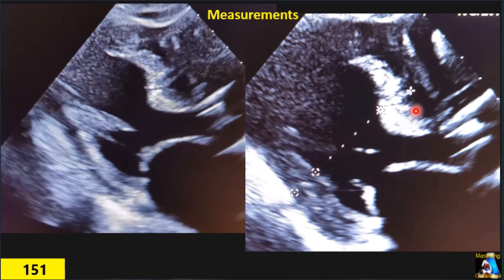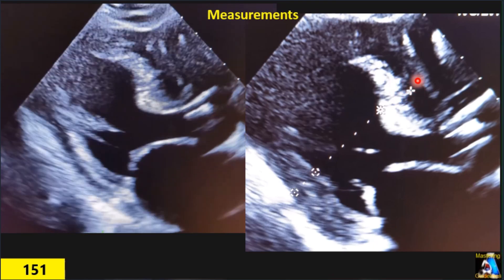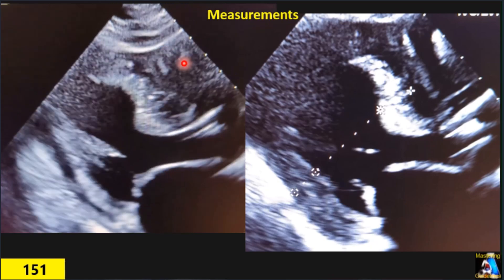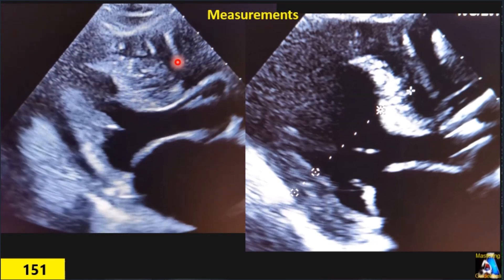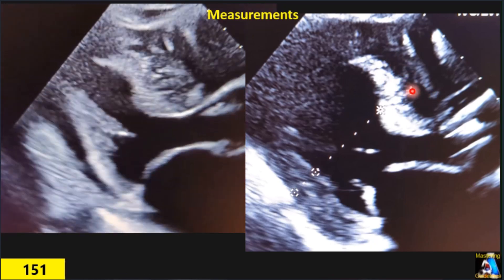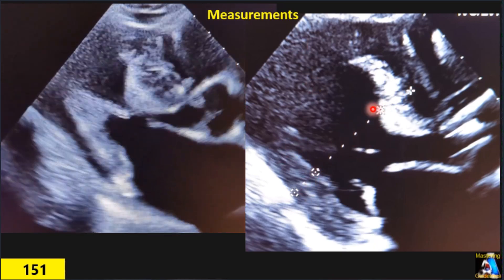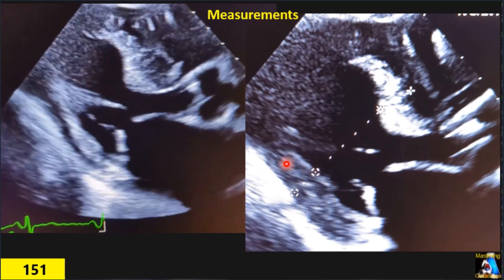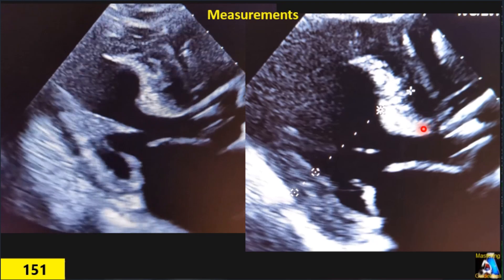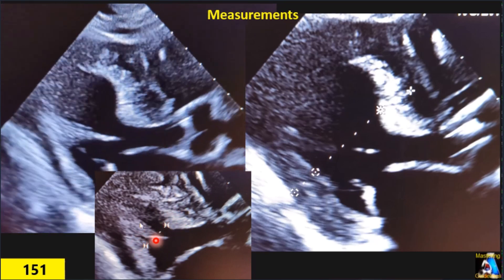Another mistake: because optimization is incorrect, I cannot see the border on the right ventricular side of the IVS. Based on the cine loop, there is too much trabeculation due to being off-axis, so you cannot see the IVS ventricular border. When you don't see the border, don't measure it — just leave it and measure the LVID and posterior wall where you can. For measuring IVS, always compare with the PSAX view. On PLAX, don't measure at the level of the sigmoid.